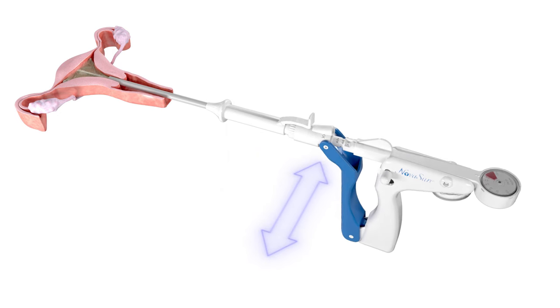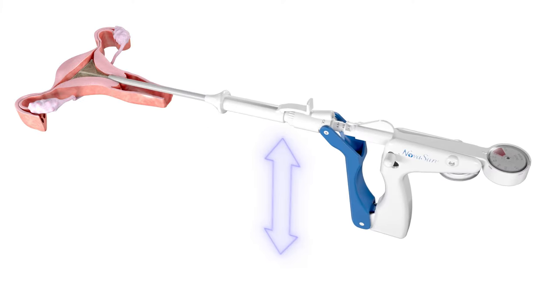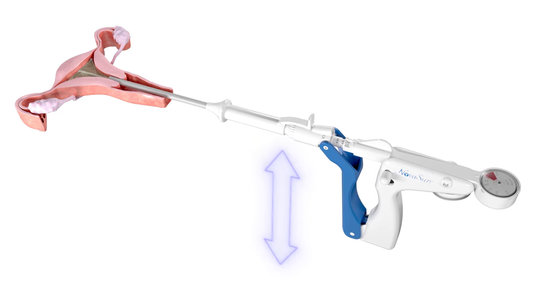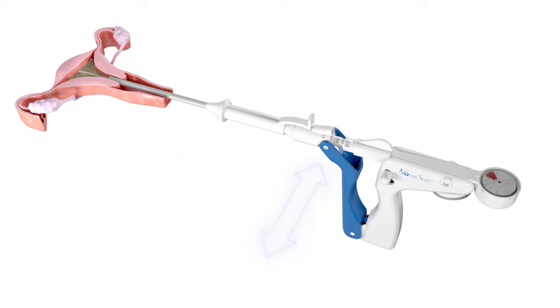Then gently rotate the handles of the device 45 degrees left and right until the handles lock. The width dial should read greater than 2.5 centimeters. Once locked, gently move the disposable device using anterior, posterior, and lateral movements to the left and right.